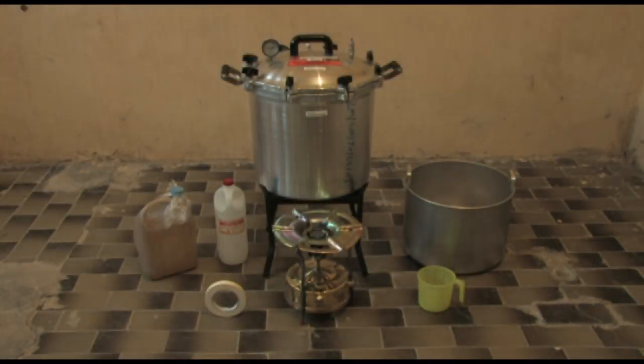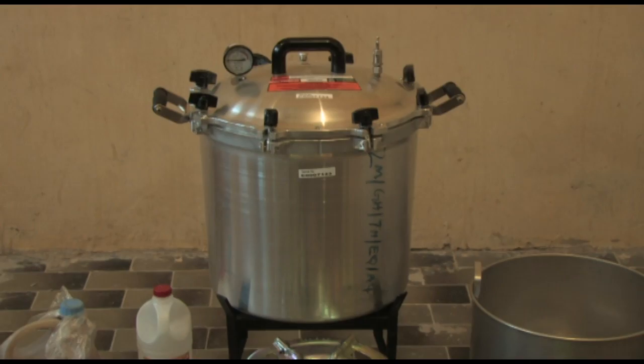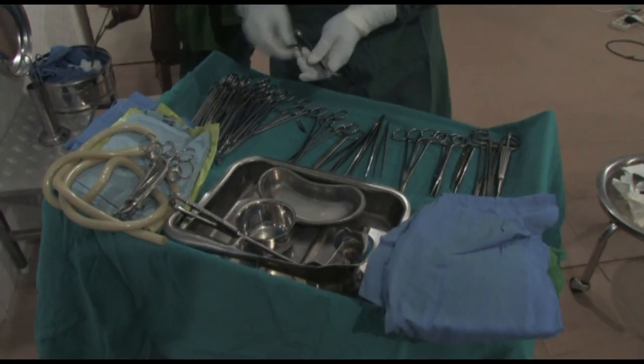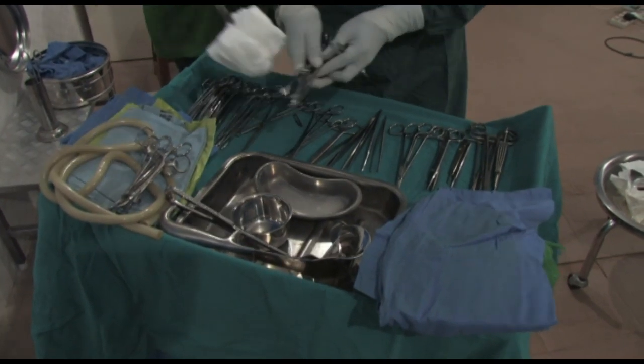This autoclave is single-walled and has a capacity of 39 litres. It is externally heated with a kerosene burner or an electric stove. This steriliser is suitable for harsh rural conditions without an electricity supply or running water. It's manually operated, and when operated correctly, it provides safe, sterile products.